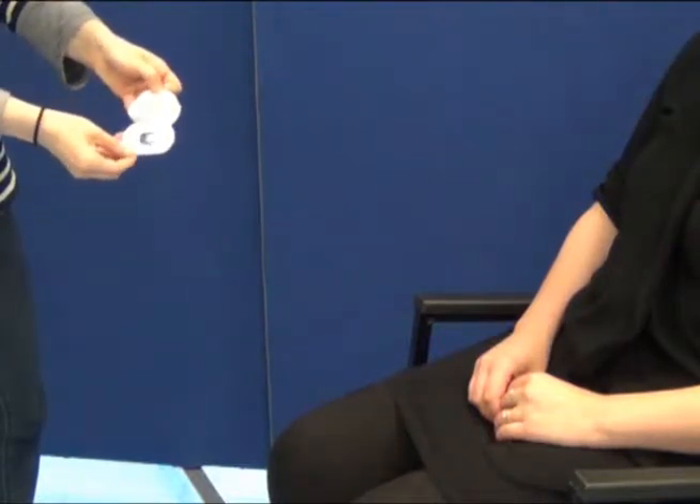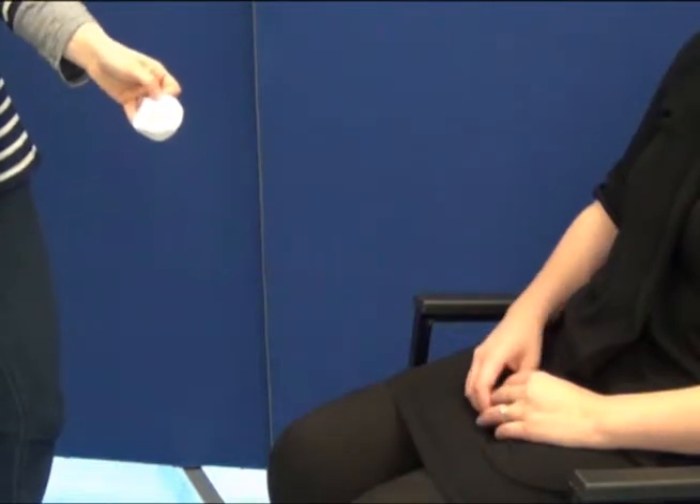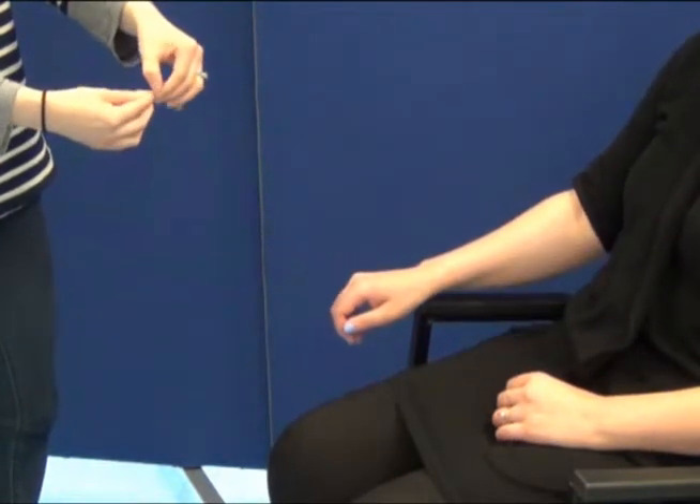Today we will be placing the electrodes distally on the bony regions of the wrists and the ankles. Let's take a look.